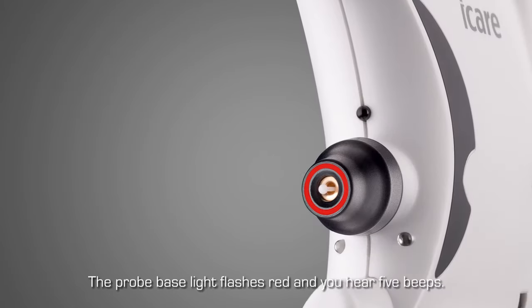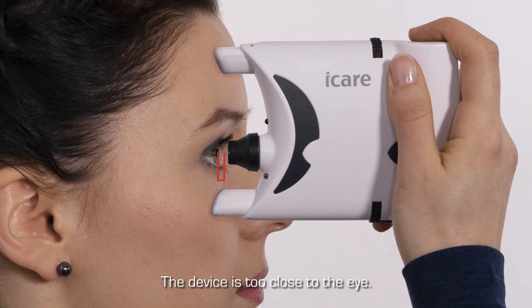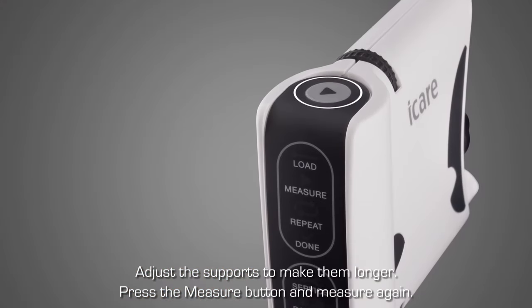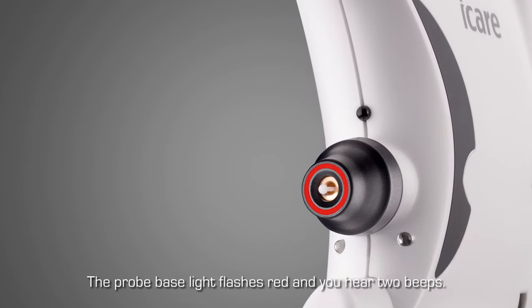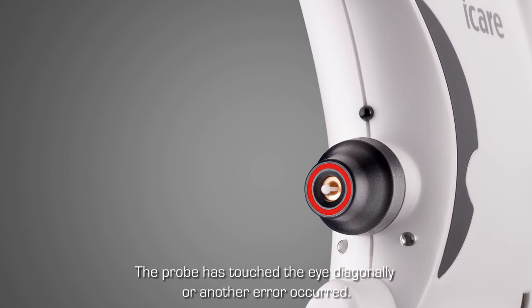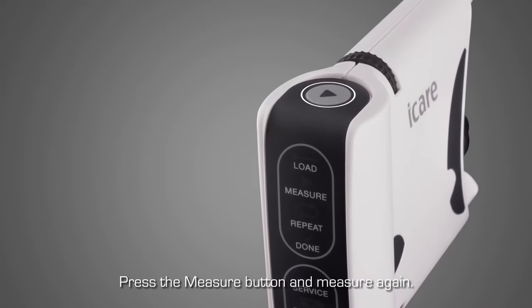If the probe base light flashes red and you hear two beeps, the probe has touched the eye diagonally or a measurement error has occurred. Press the measure button and measure again.